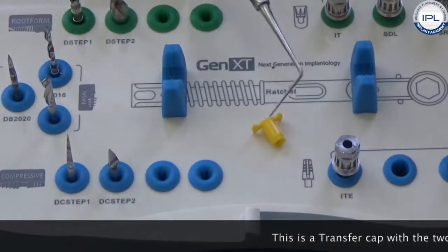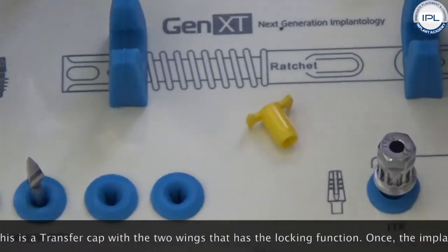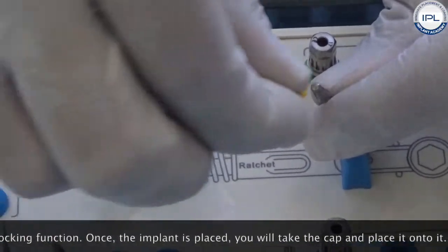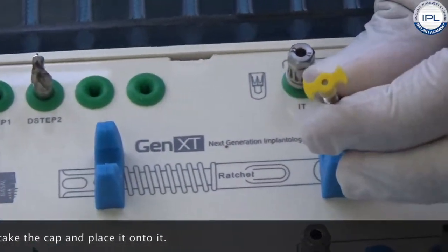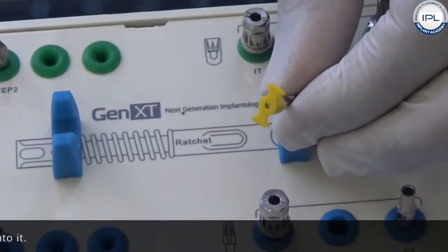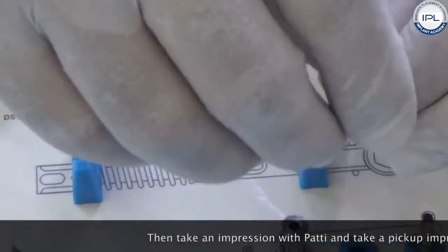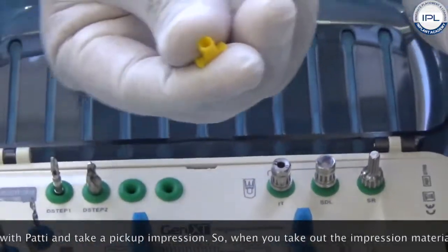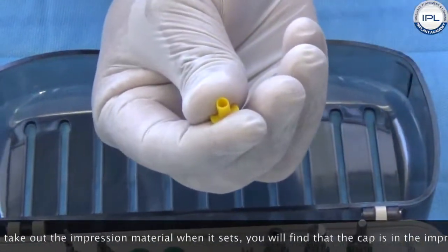This is the transfer cap with the two wings. It has a locking function, so once the implant is placed you will take the cap and place it onto it. Then you will take an impression with putty and pick-up impressions. When you take out the impression material once it sets, you will find that the cap is now embedded in the impression material.